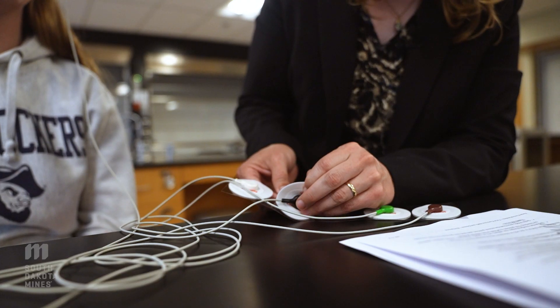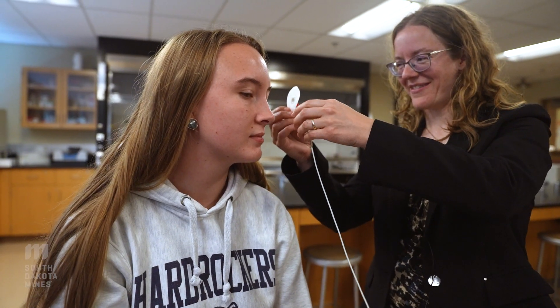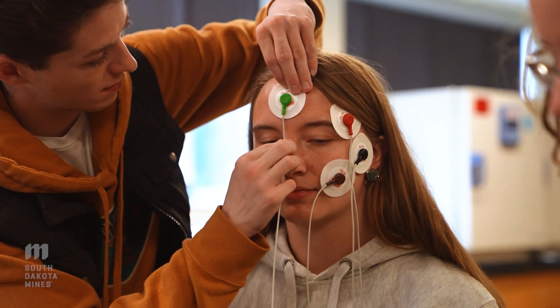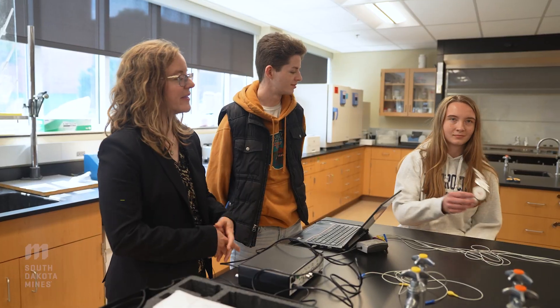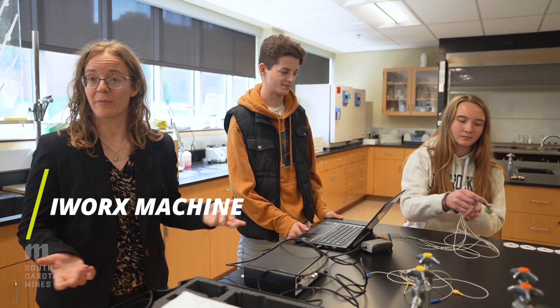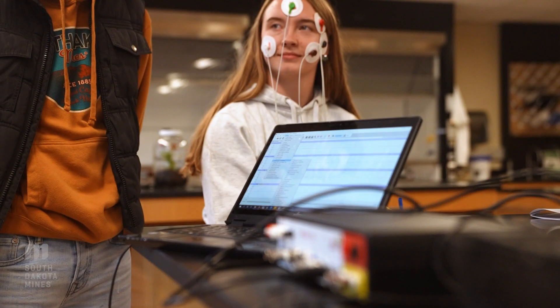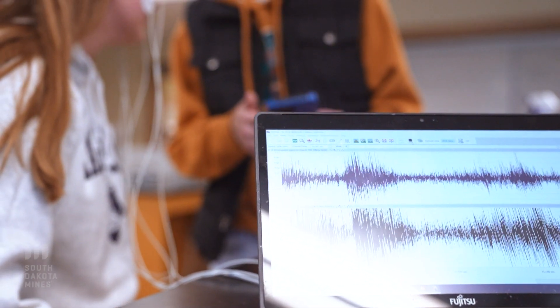I'm going to introduce to you an iWorks machine. It shows students how to see what a normal muscle looks like versus an abnormal muscle. We have our electrodes and they are hooked up to different muscles in the body, and then they are recorded onto our laptop and then we can analyze them further.